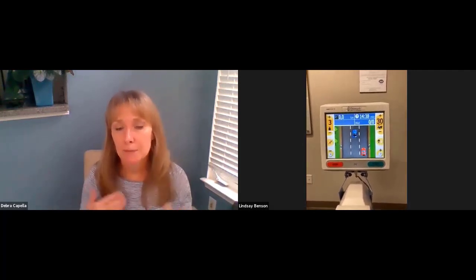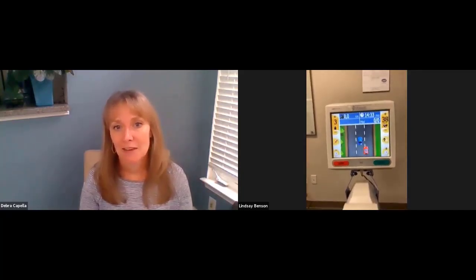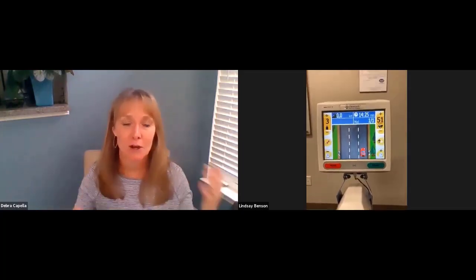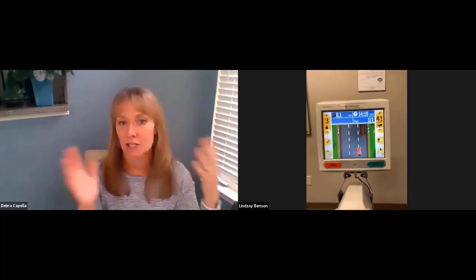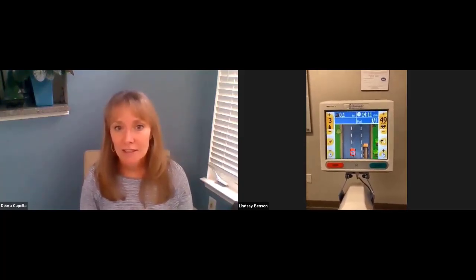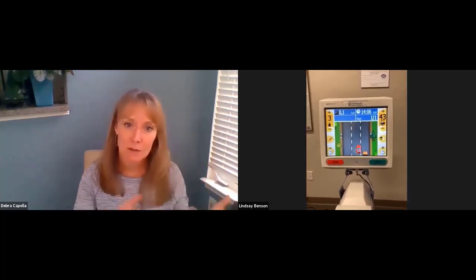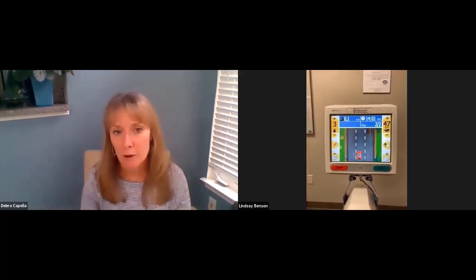If she speeds up her RPMs, so Lindsay, go as fast as you can. I might hit the car. Right leg, right leg. Perfect. You can see that the scenery starts going by faster and she reaches that car. So the higher RPMs will actually move the scenery. And now there's another vehicle, so she's going to need to get out of the way from that one and go back to either even cycling or use her left leg. Perfect. So this was designed to give you an idea about how all the stuff I talked about seamlessly works into a relatively quick setup and initiation of a program for a patient.